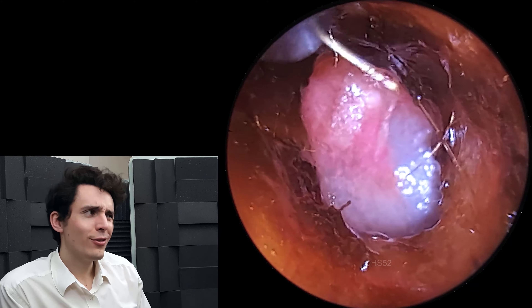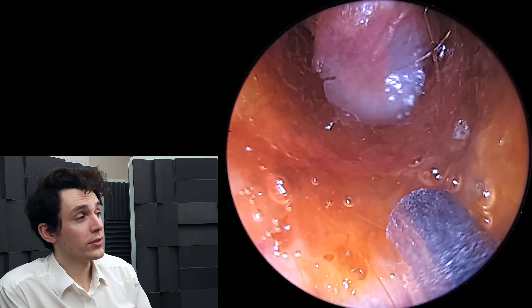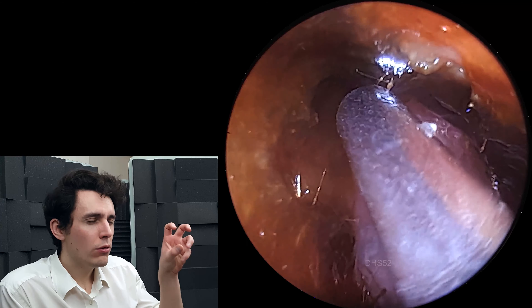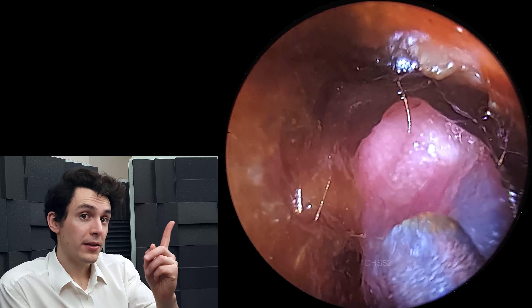You can see a much clearer eardrum now — it looks a little inflamed actually, so around the handle of the malleus it looks a little red. This is a right ear, and we know that because the handle of the malleus is pointing to the right, at about two o'clock or maybe one o'clock in this image. You can see that little white spot — that little white ball on the eardrum — that is the handle of the malleus, the lateral process of it. It's usually like a stick with a ball on the end, just poking out of the eardrum. I'm sure that redness will recover with time given just how much the patient has gone through regarding this wax blockage.